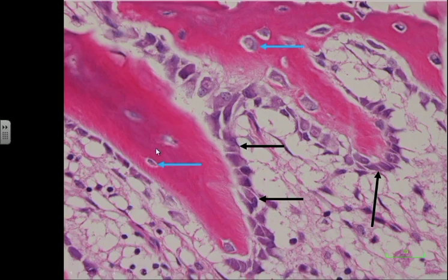From the first video, we identified that bone is characterized by pink matrix. So you can see this pink matrix characteristic of bone. We'll leave the pink matrix and focus at the edges of it. There we identify these purple-rich cells surrounding the bone. It even takes its curvatures with it because it's just one cell thick but going along the length. So one row, each single cell in a row, going through the length of the bone.